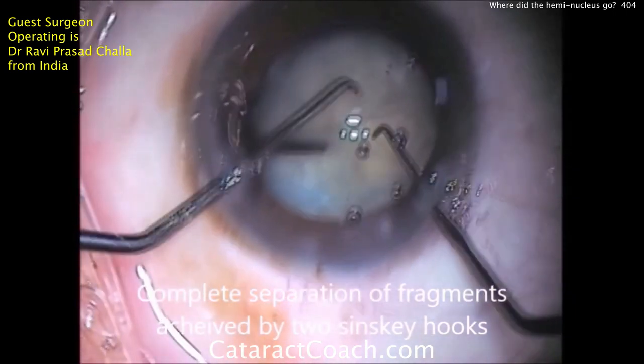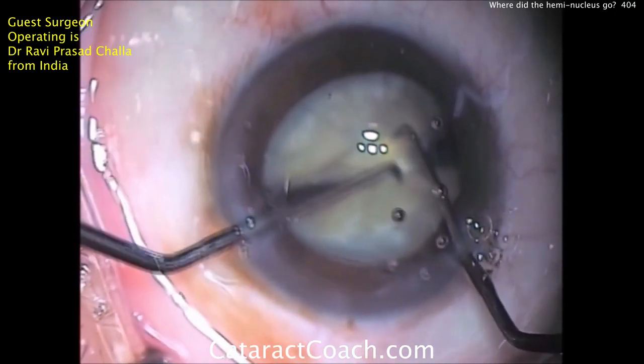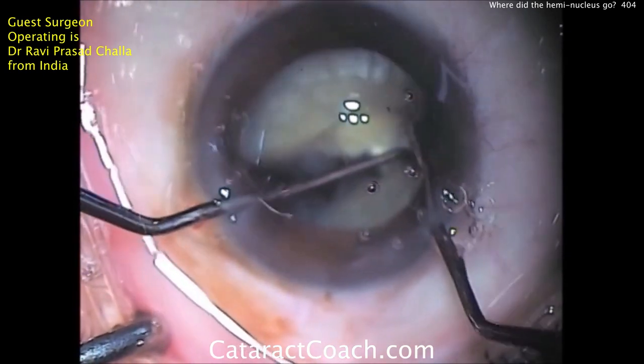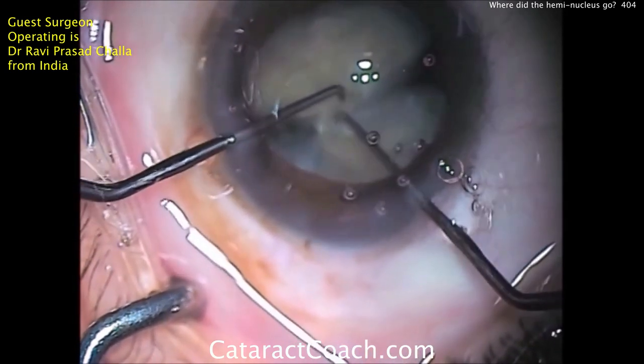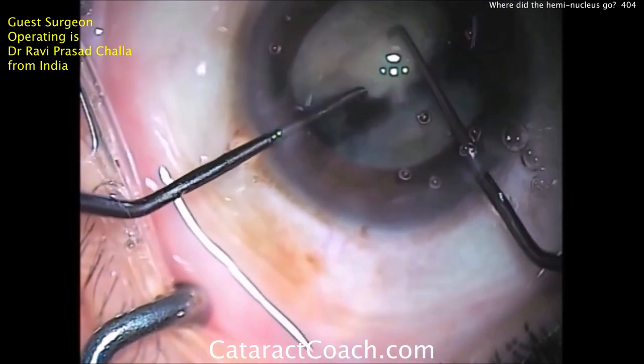Here's where I want you to watch very carefully. As the two halves are separated, look how far apart they are — look at that huge gap between the two pieces. Where's the piece that's sub-incisional? There's that last bridge that's being broken. Now we have two fully separated halves.